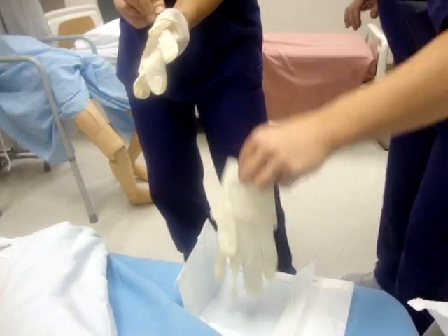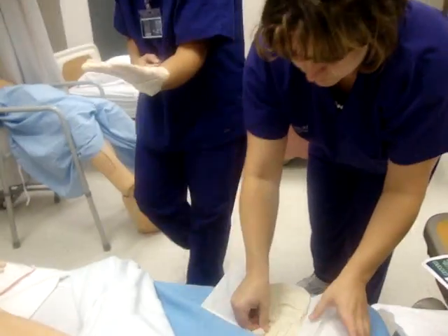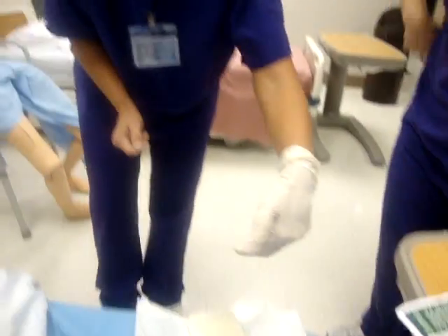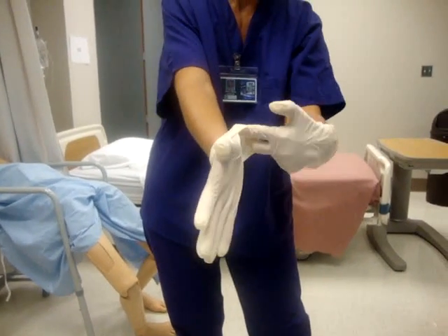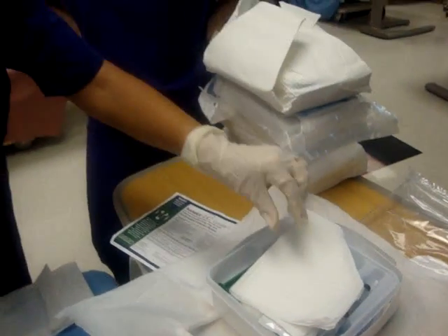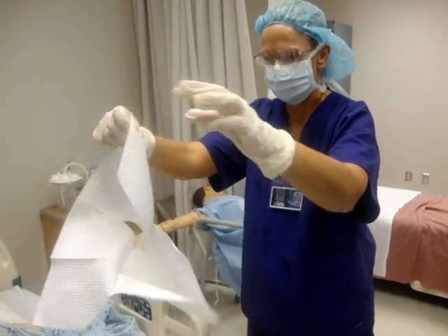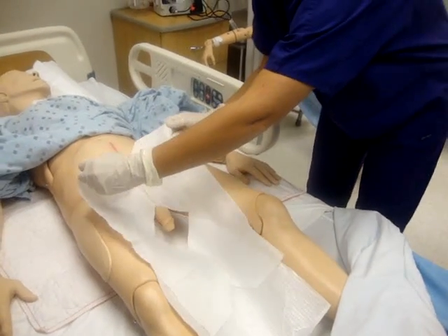Reach in like that. You should pick this up, step back, and put that glove on. Then leave the cuff like this until you've got your other one on. Go ahead and pull it through. Now this one — I have to go under the cuff. Watch these flaps and try not to let it roll. Don't touch yourself. Now the fenestrated drape goes next. Now I'm sterile-ish. Your fingers are sterile. Open it up, fix it first before you get close to the non-sterile skin, and just lay it over. That goes on first for a woman too.